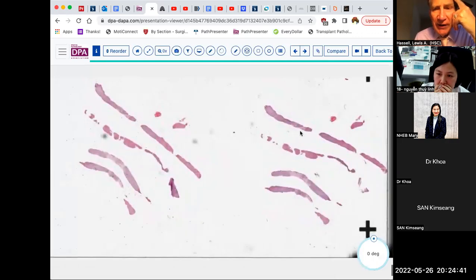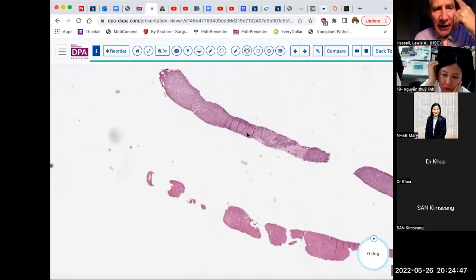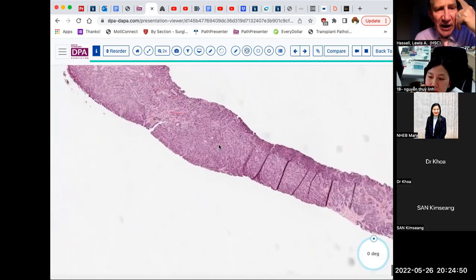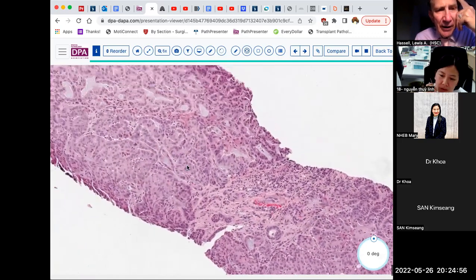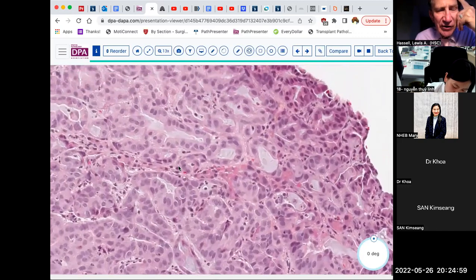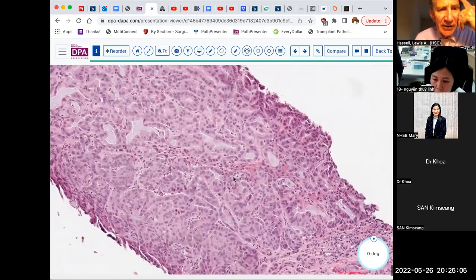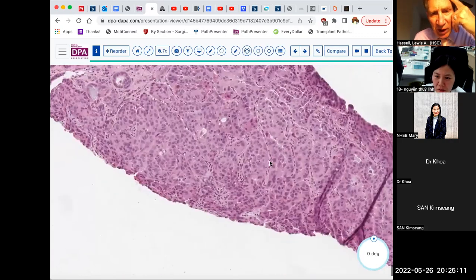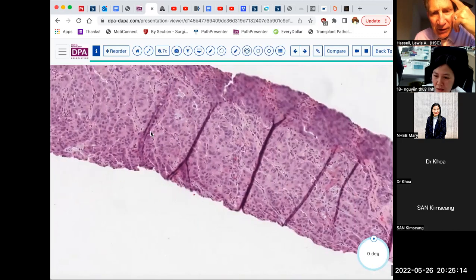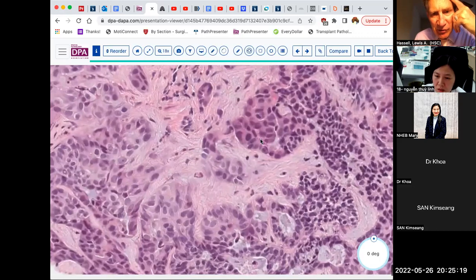So let's start with a needle biopsy. Here we see several cores, and these are fairly cellular, so they're not highly fibrotic. But you can see how, looking at a tumor like this, you might wonder about breast cancer, or maybe pancreatic cancer, or you might wonder about even lung cancer, possibly. Sometimes it can give a picture similar to this. Some small nested glands, a little bit of mucin, occasional more solid areas, as you see here.